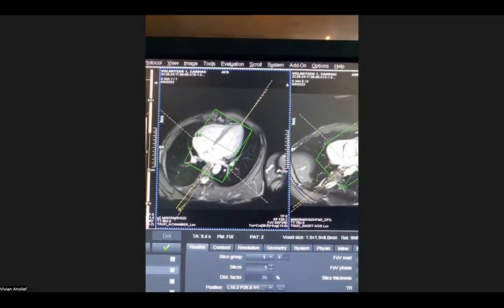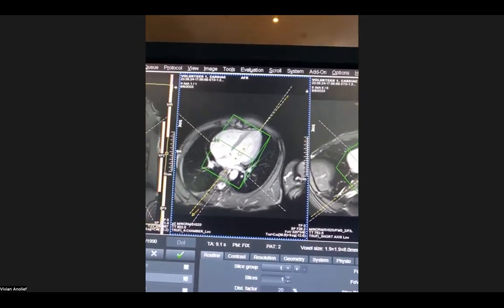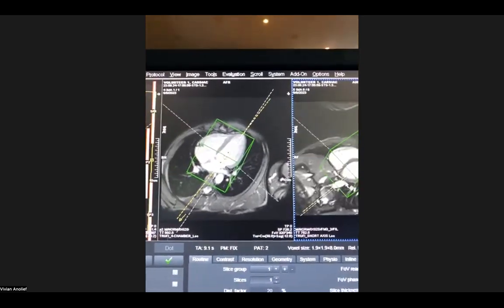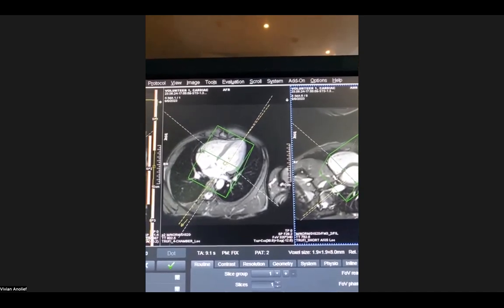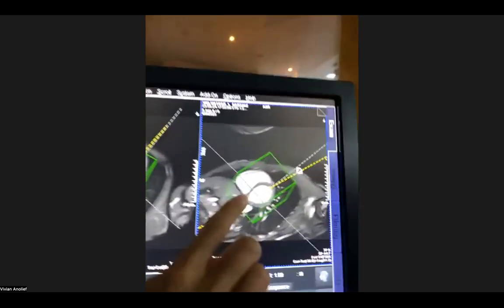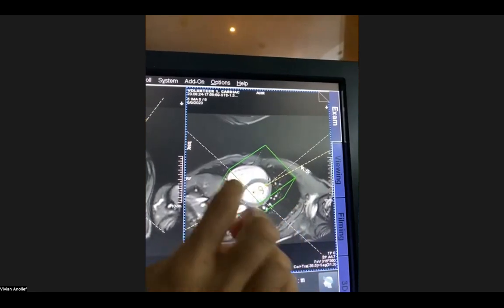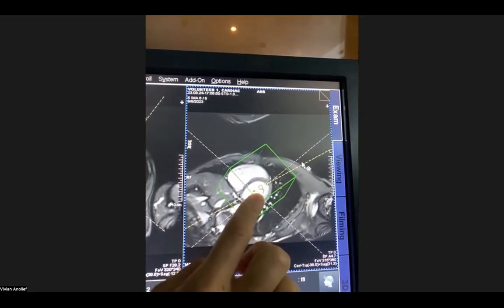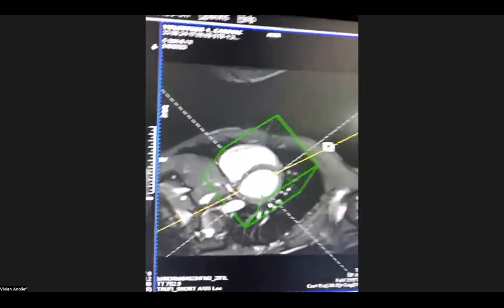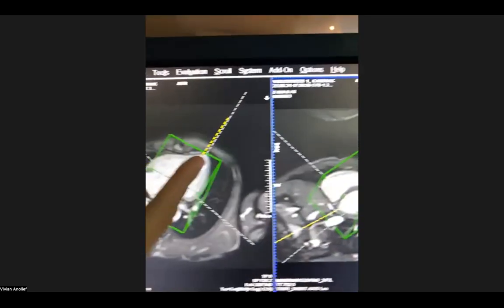Center of the slice is the mitral valve plane, and then using the short axis that we acquired, so going towards the mid-ventricle slice and making sure that the line is parallel to the insertion points, the right ventricular insertion points. So these 2 points here, and here, that's what we call the insertion points, where the right ventricle latches onto the left ventricle here, and this line should be parallel to that to get a proper two-chamber view. And then on your four-chamber view, it should be going through the apex.